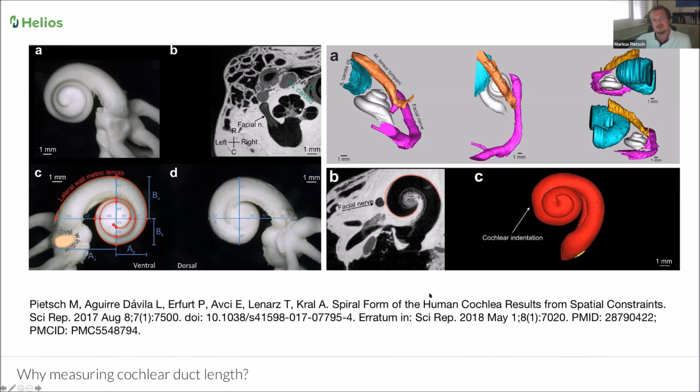about the very brief measurement of those corrosion casts. And it was a collection of 108 of those corrosion casts that Peter Erfurt made for many years. And what was very interesting, those corrosion casts show things in a very brief and very reproducible way. We saw special things you could overview very easily if you look at only one of those corrosion casts. But if you look at many of them in the same view, you find special things.